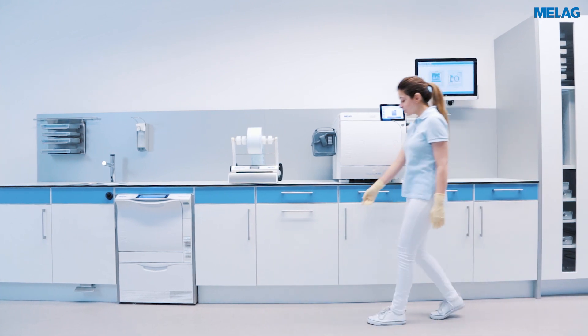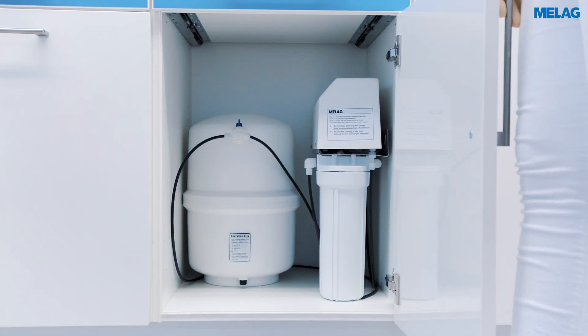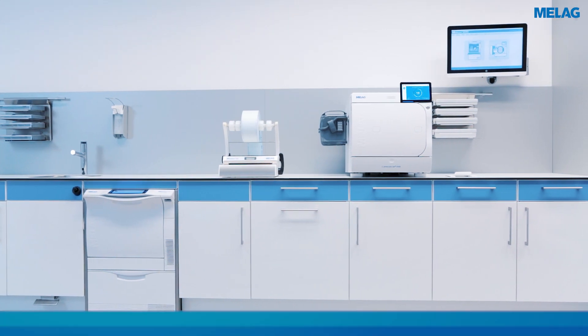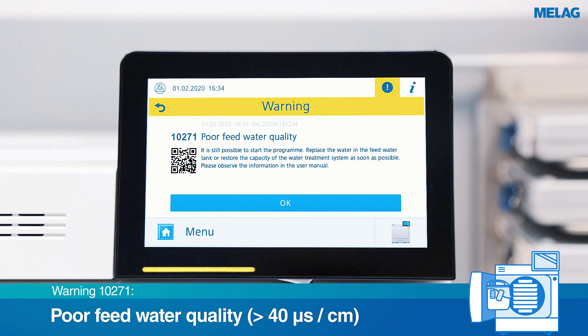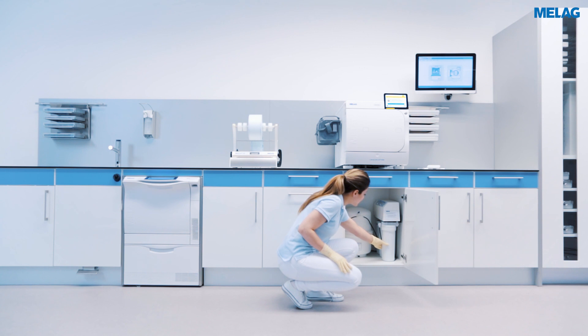The Miladem 47 Water Treatment Unit supplies CareClave with demineralised water for the reprocessing of instruments. CareClave automatically checks the conductivity of the demineralised water during the process and issues a warning message if the quality is poor. As soon as the warning message is displayed, the mixed bed resin cartridge should be replaced.